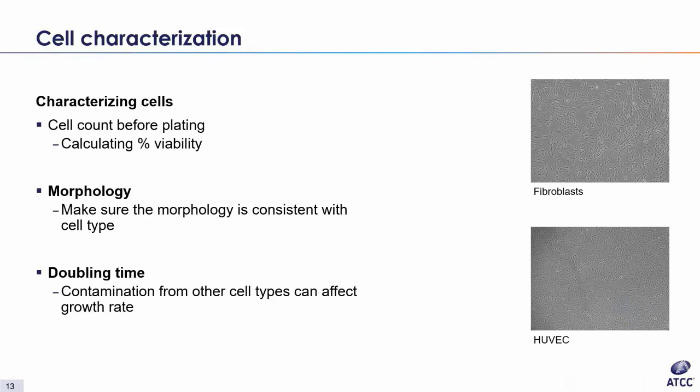As we leave the discussion on cryopreservation, I want to discuss cell characterization as it relates to our upcoming topic of general cell health, contamination, and authentication. It is necessary to characterize cells to determine how healthy and viable they are, as well as making sure that they are the cells you think they are. Simple cell viability counts using trypan blue with the hemocytometer are an easy way to determine the percentage of live cells over dead cells. With this method, live cells appear to have bright centers while dead cells appear dark blue as the dye penetrates the compromised membrane.